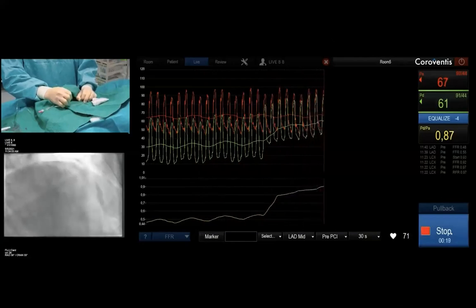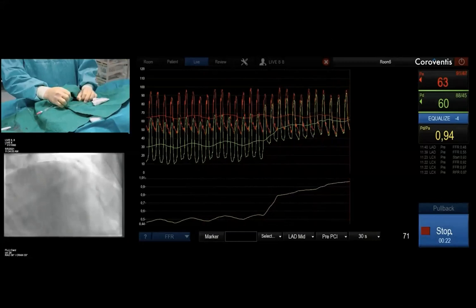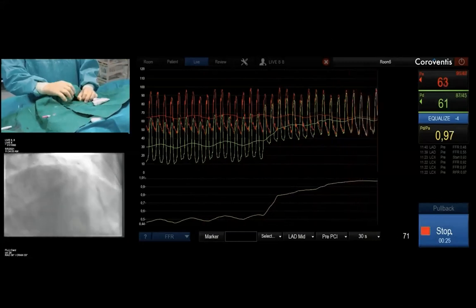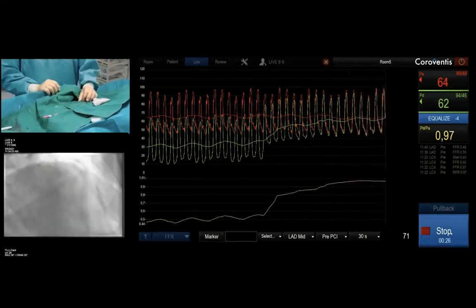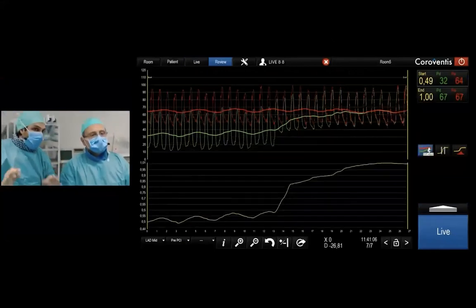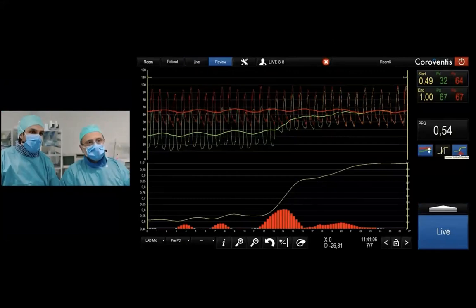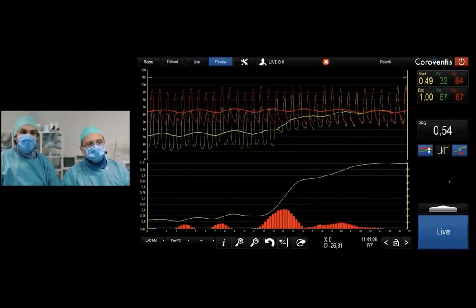You will see immediately how there is a big jump in the middle LAD and diffuse disease in the proximal LAD. We are going to click on the stop button as soon as the sensor reaches the catheter tip. Look at this pullback — this is a perfect pullback. You see the morphology, there are no artifacts, and we calculate the PPG. In this case the PPG is 54.